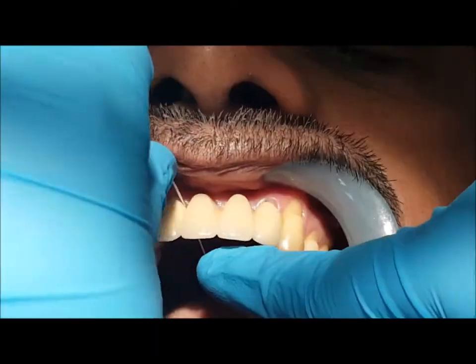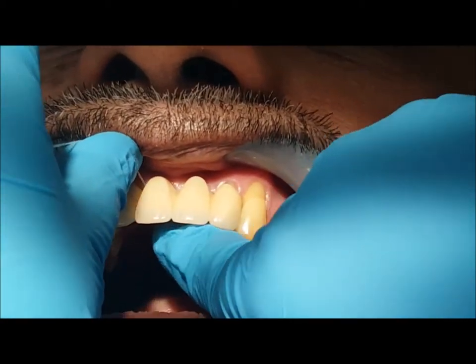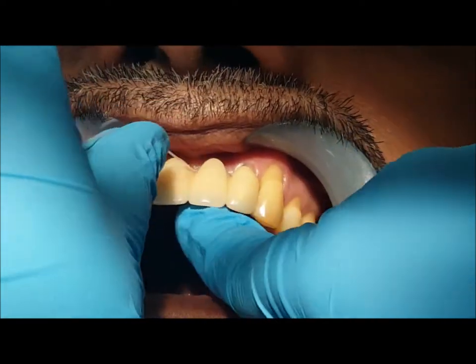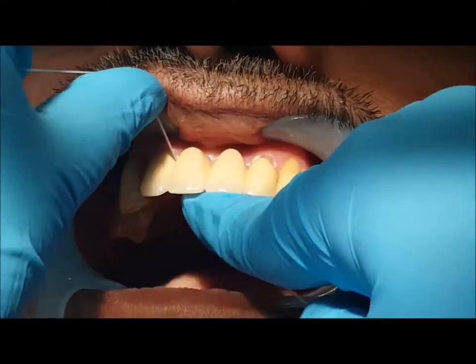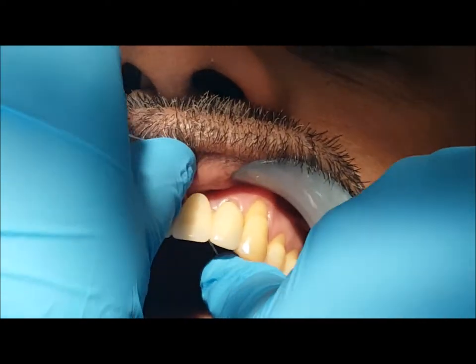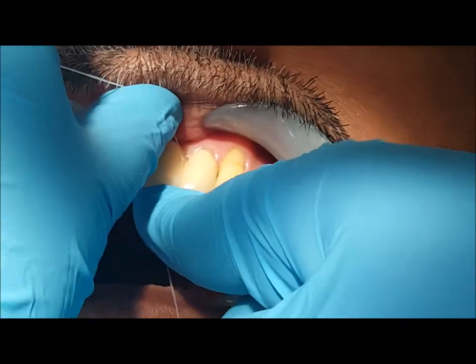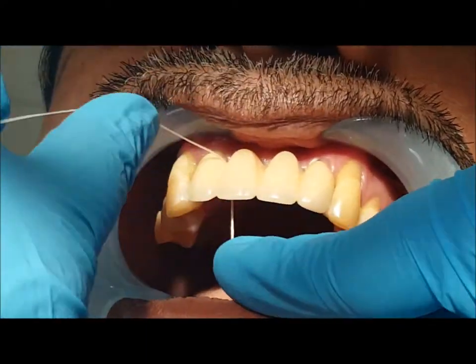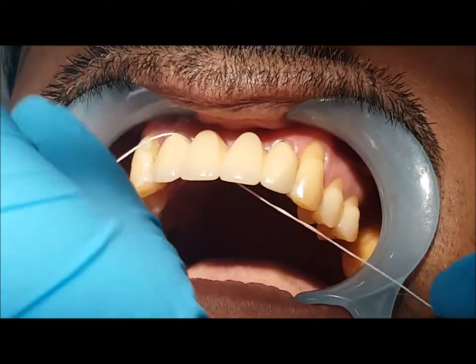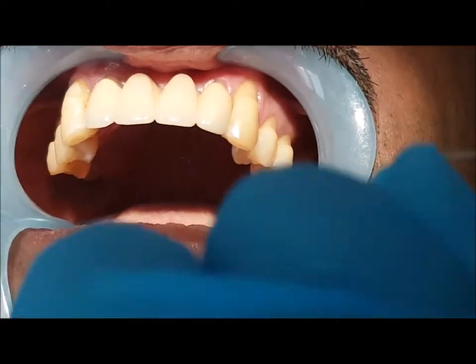We have inserted our floss inside the bridge. We are going through the entire bridge and cleaning the bridge surface with the floss, where food and debris can get stuck. This is the most important part. After flossing, take the floss out safely — do not injure the gums.